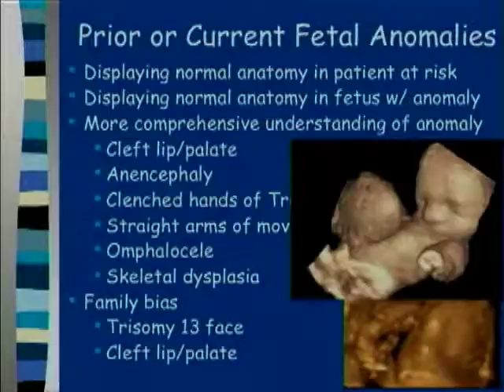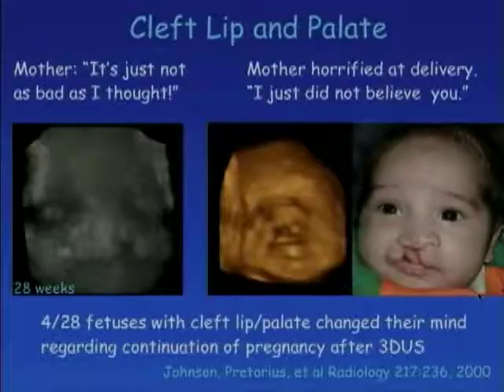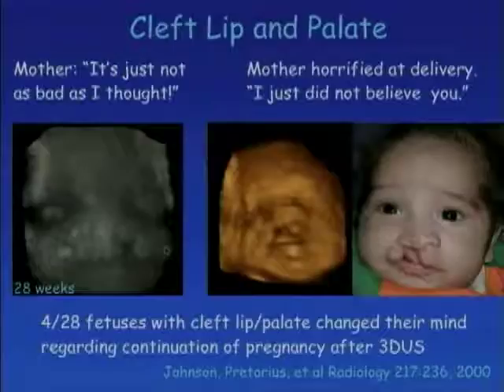That's just our little fetus with the omphalocele, and the family really adored having the picture of the face because all of a sudden they could think about it that way. When looking at clefts, I think this cleft, this family at 28 weeks, which I think it's a study from a long time ago, but the family said this cleft is just not nearly as bad as I thought it was, and they decided to not terminate when they had planned to terminate for it.